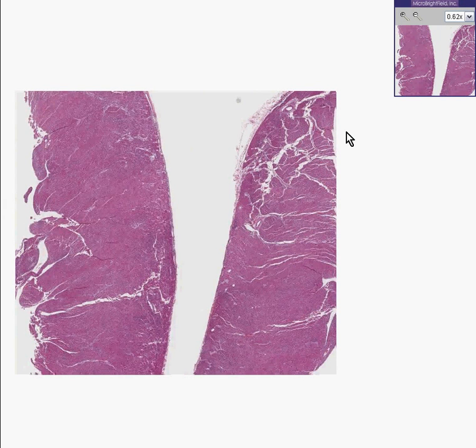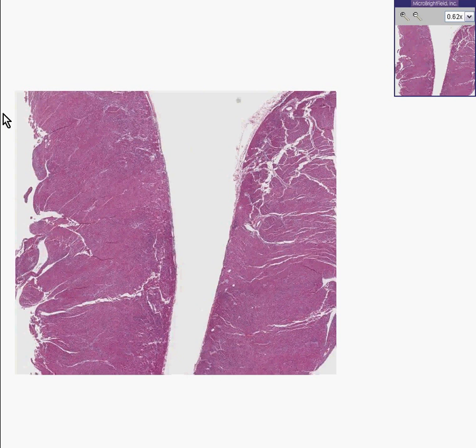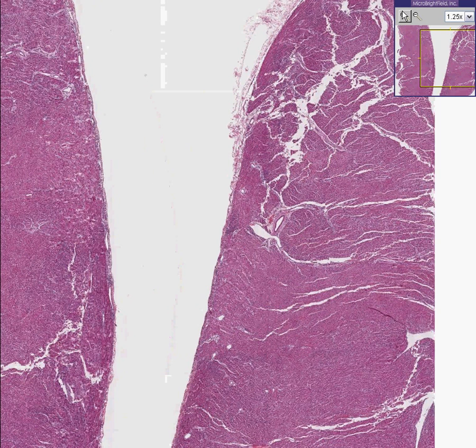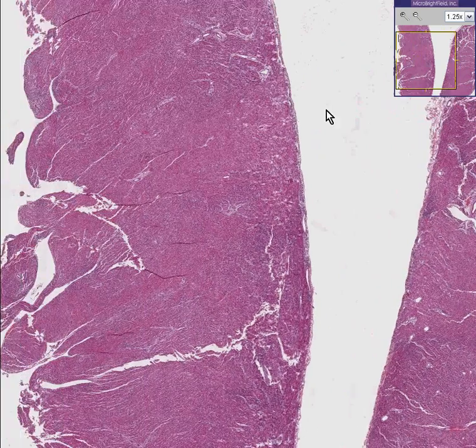Here is another nice great full thickness histologic section of a heart. The smoother side would be the pericardial side and the more trabecular side would be the endocardial side. Let's look at it just for a general inspection. Doesn't look too bad offhand.